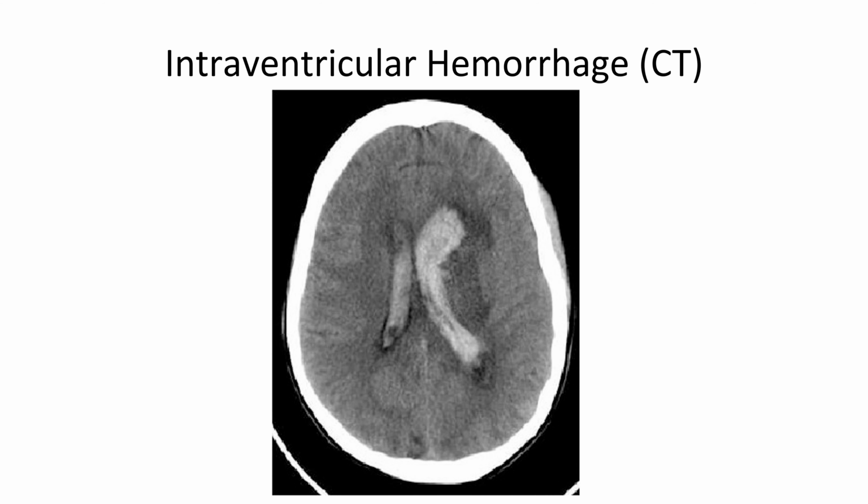So you can see on all of these CT scans, when we make the brain tissue bright enough to look at, it makes the bone really, really bright, overly bright. And so in order to look at the bone windows, you have to really bring down that brightness. And that's called a bone window. When you really enhance the brightness to look at the brain tissue itself, it's called a brain window.